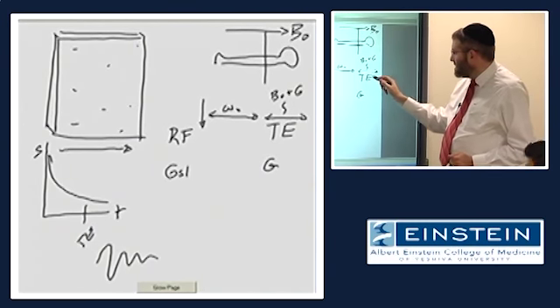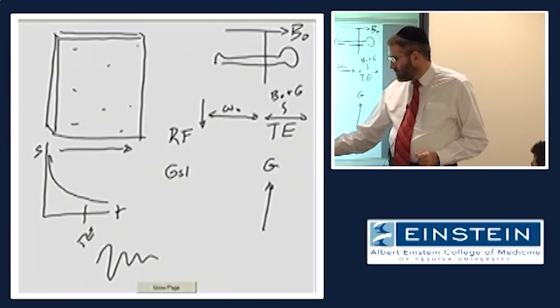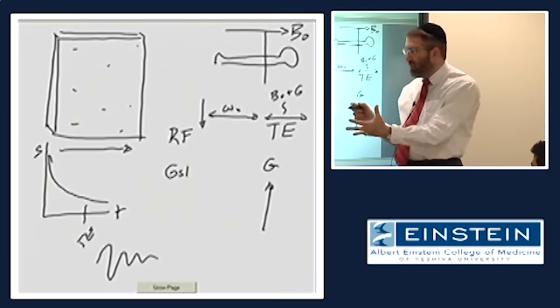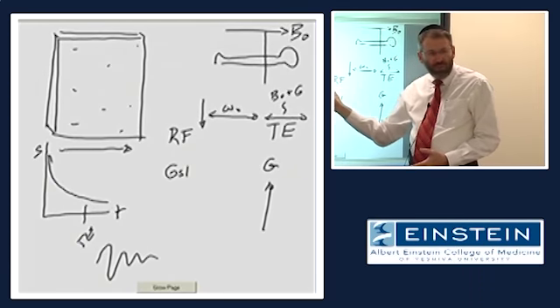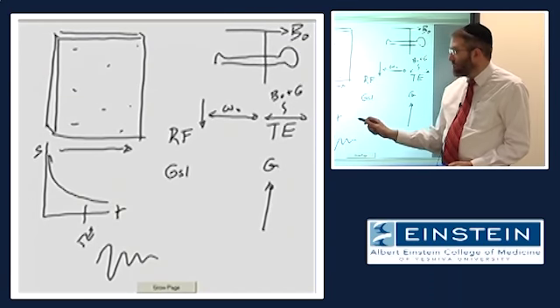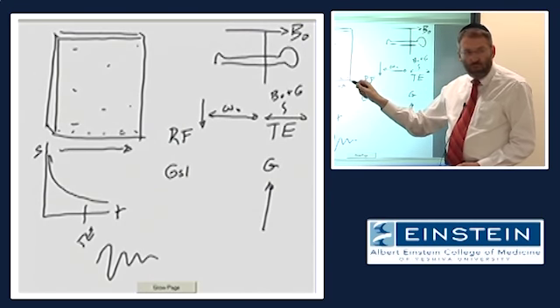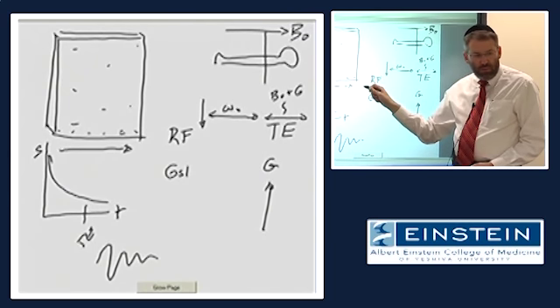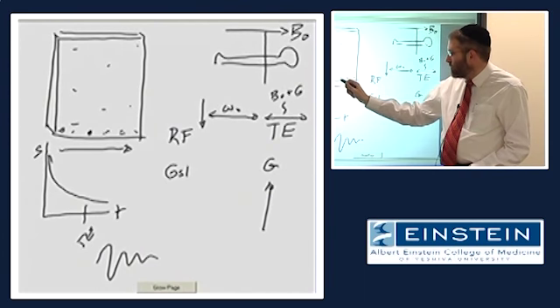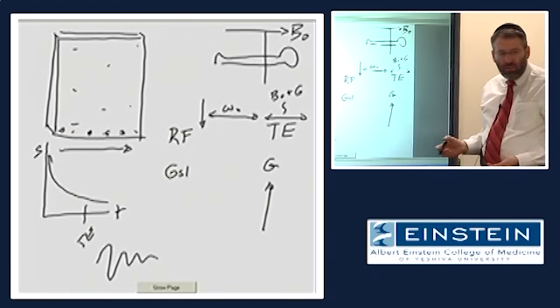So when I sample the signal at this time TE, there's only one signal. I have a single coil that measures the summation of all of this information. But realize that now this signal is composed of a whole bunch of different component signals, each of which has a different frequency, right? So there is, first of all, different amounts of signal amplitude at different locations in the image, simply depending on what kind of tissue is there. That's what we're trying to figure out, right?